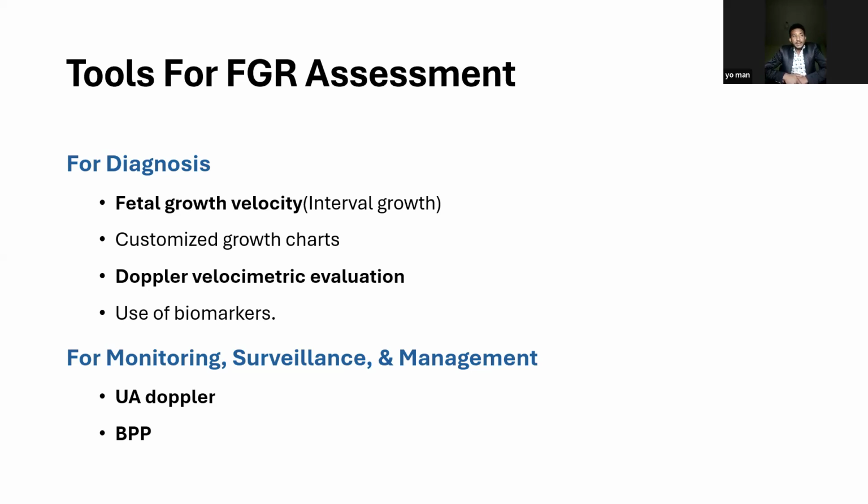The use of biomarkers like placental growth factor is beyond the scope of this lecture. So if you use fetal growth velocity and Doppler velocimetric evaluation for diagnosis, then for monitoring purposes, it's usually recommended to do the umbilical artery weekly or monthly, and the biophysical profile also helps us to monitor those patients who were previously suspected or confirmed for FGR.